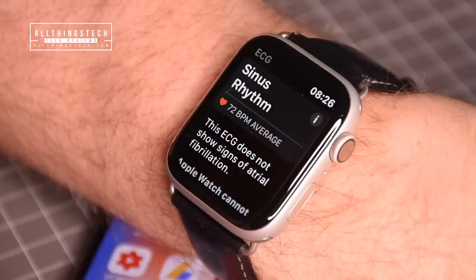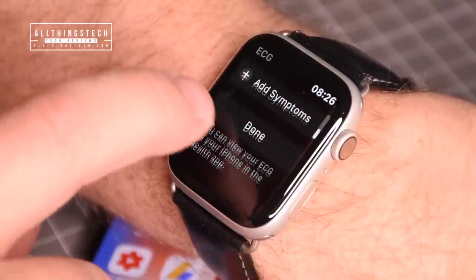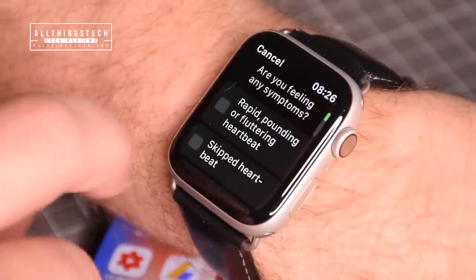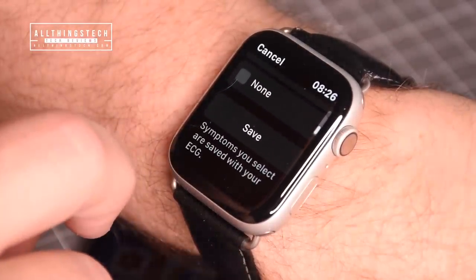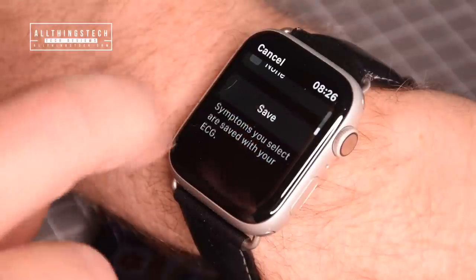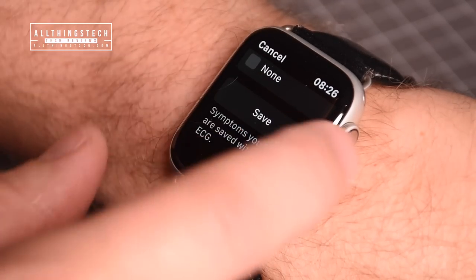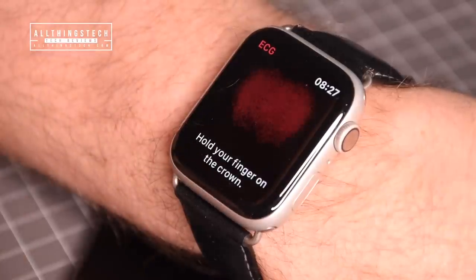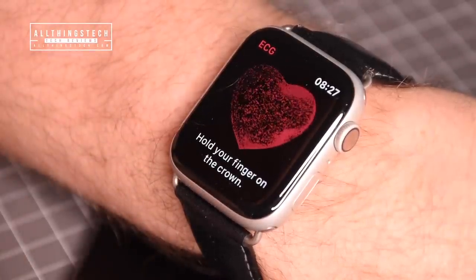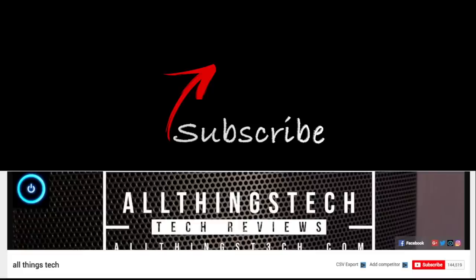At any point you can go back and retake an ECG. You can also add symptoms on the watch — such as rapid, pounding, or fluttering heart, fatigue, shortness of breath, or dizziness — and save them. If you're feeling unwell and run an ECG with allocated symptoms, that information can be shared with your doctor later. That's the ECG feature — it's brilliant and now available in many more places.